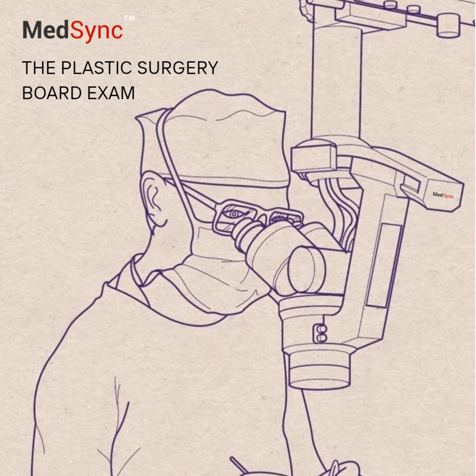Then the device goes on. Yep. Apply the chosen distractor, fix it securely to the bone segments. And then you wait the latency period. Why wait?